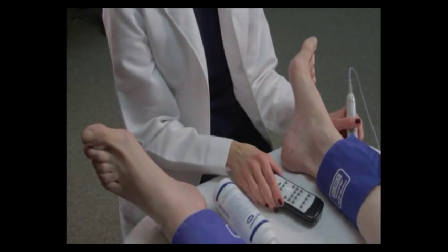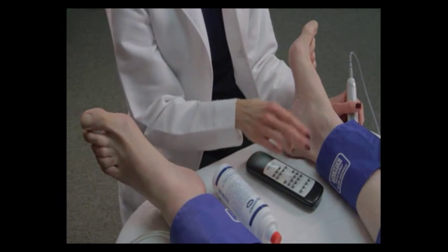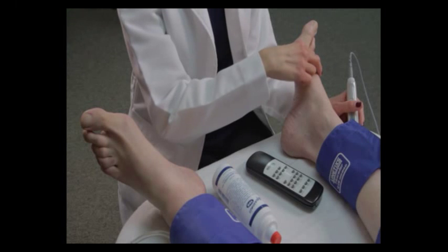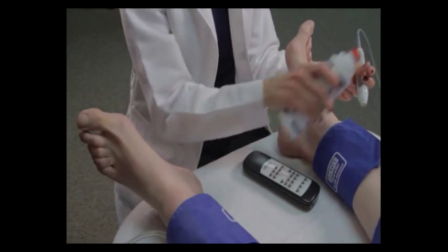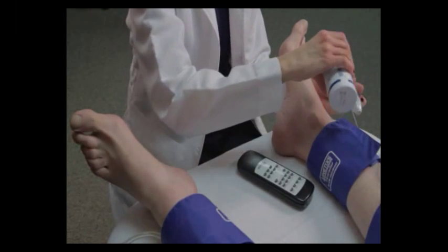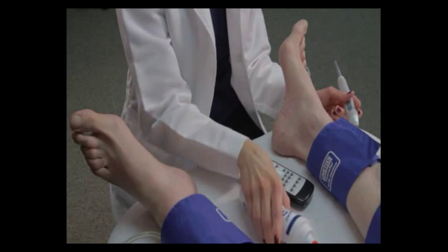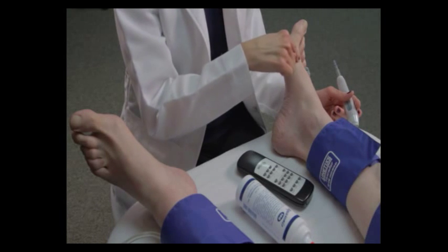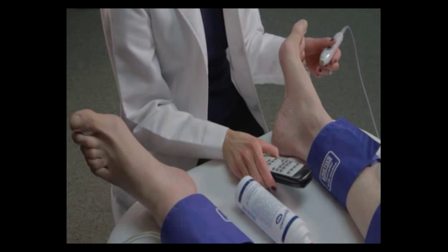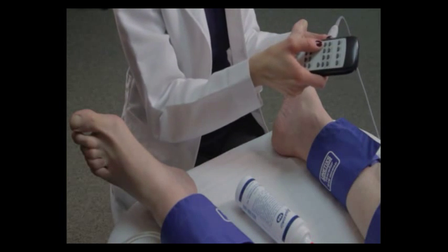To obtain a dorsalis pedis pressure, first of all, you must locate the dorsalis pedis artery. I like to palpate with my fingers, and if I feel a pulse, I will put some gel right where I feel the pulse. If I do not feel a pulse, I will put some gel on the midfoot and sweep across the top of the foot in a straight line laterally, slowly. The remote control is being used at this point to control the instrument from the patient's feet.